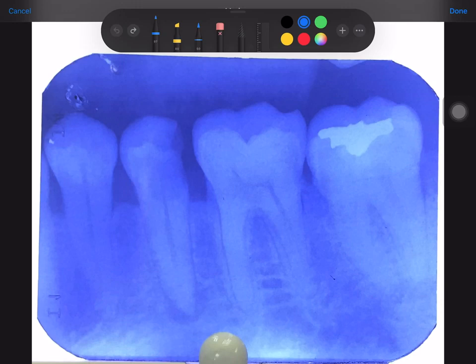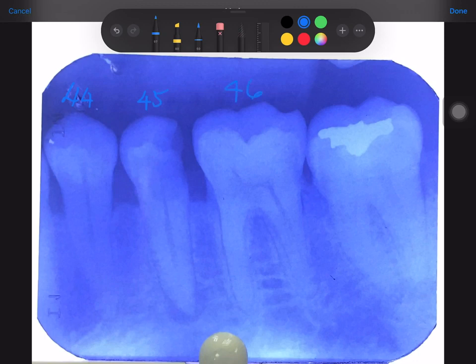This is a mandibular radiograph. We can see teeth and, assuming from the dots, it's probably the fourth quadrant. So this must be tooth 4-4, and our tooth of interest is 4-5.